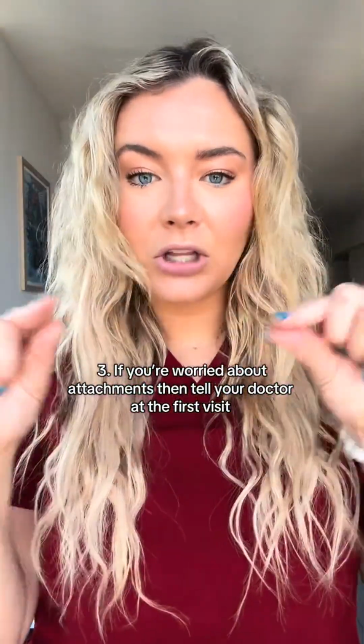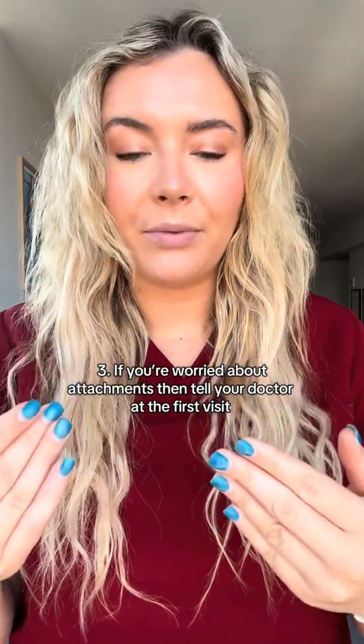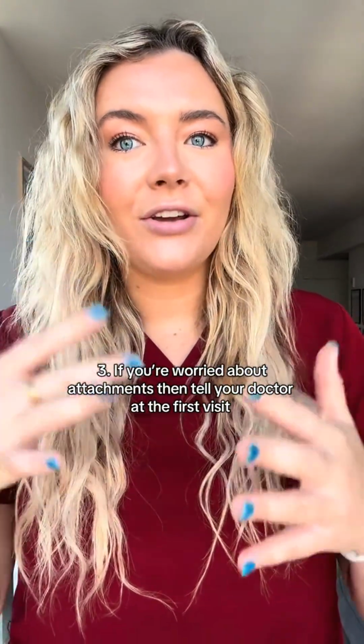Okay, number 3 is you will have attachments on your teeth. The small little dots, I'll put them right here, glued on. When you go, you need to ask your orthodontist if you have a specific request about your attachments. You need to bring it up at the appointment. Do not bring it up once your Invisalign is in. If that happens, you're gonna have to wait longer to get new aligners.